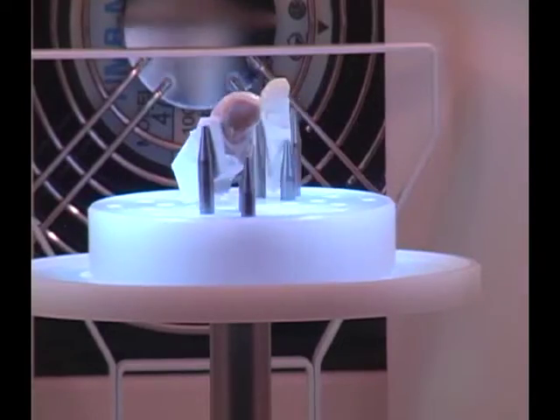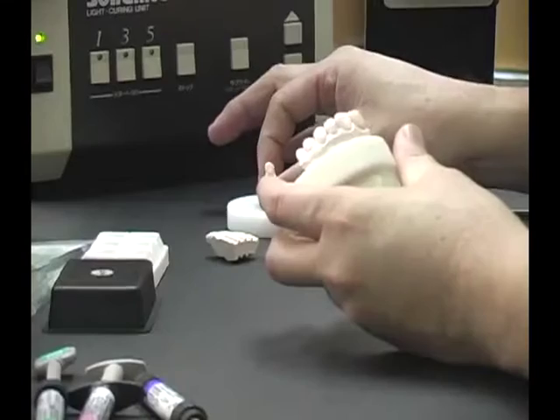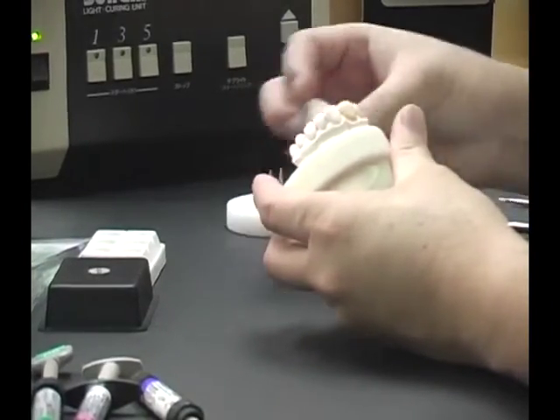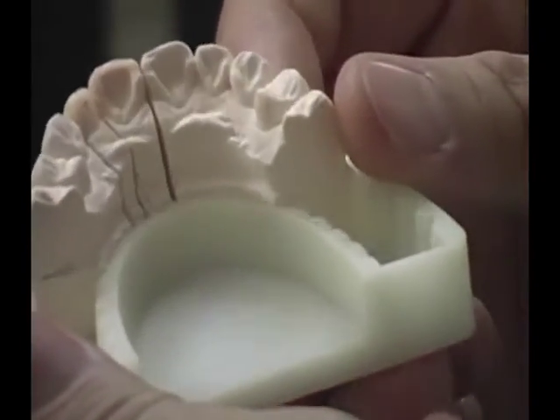Place them in the light box and cure for 3 minutes. After curing, place the dies back on the tray. The veneer build-up is complete.